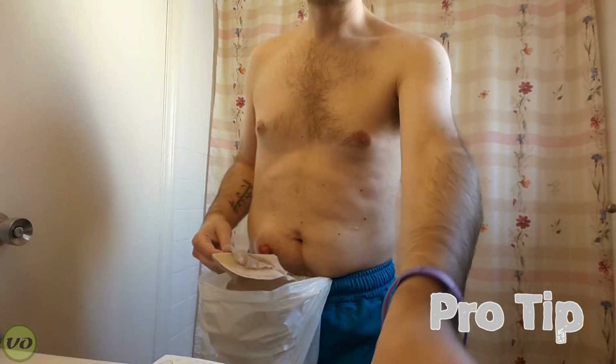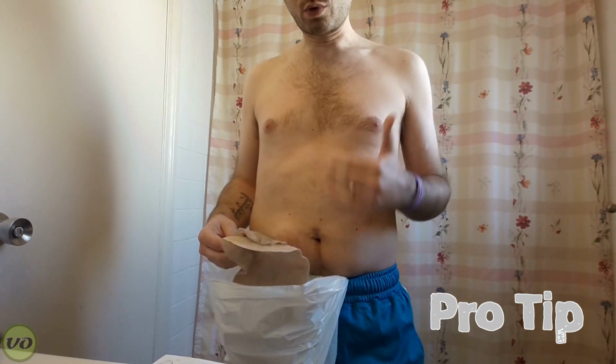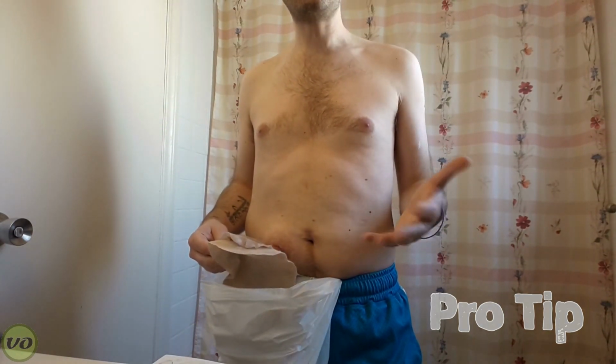Now I generally like to inspect my wafer just to see if there's any kind of erosion that's coming out that I can catch a leak on. So for example, if I notice any particular type of erosion wearing one appliance or wearing one accessory, then I would generally try to correct that the next time.